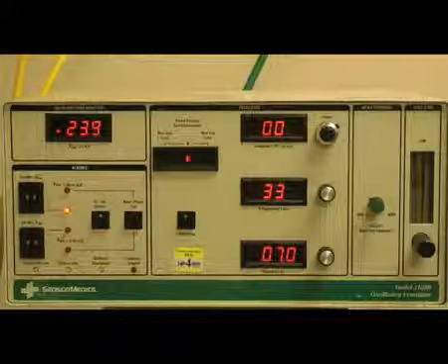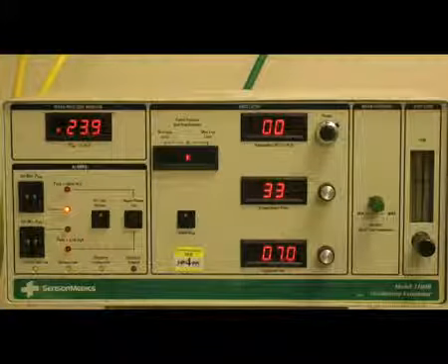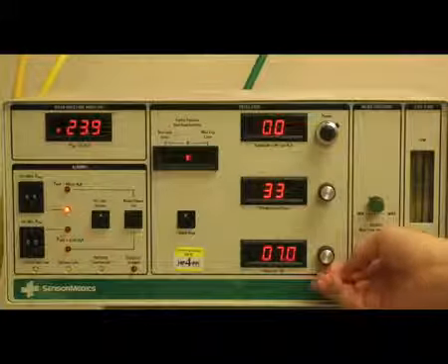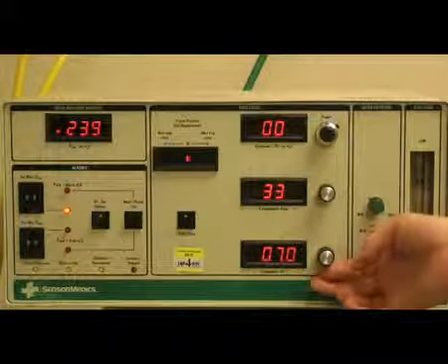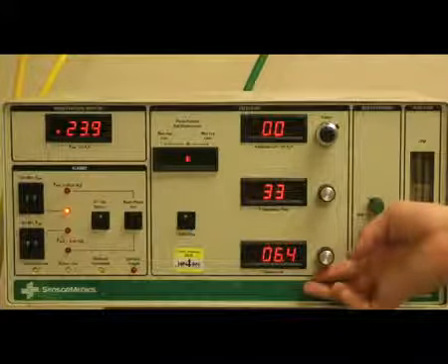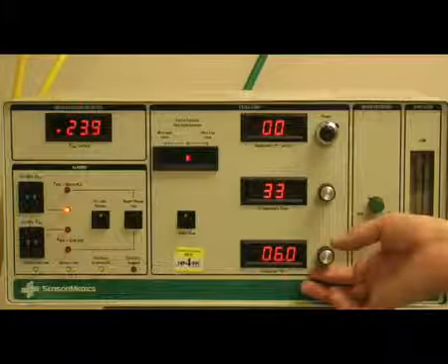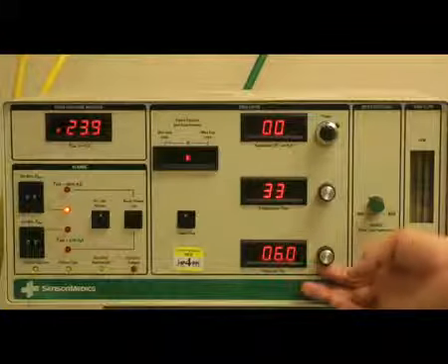When managing ventilation on an adult patient on the oscillator, it is important to remember that your Hertz is your primary control for your ventilation. Your Hertz controls your tidal volume and your respiratory rate. The higher your Hertz, the higher your rate, and the lower your tidal volume. This is important to remember when you're drawing blood gases and adjusting for the patient's pH. Again, the higher the Hertz you want, the smaller the tidal volume, which allows for more permissive hypercapnia.